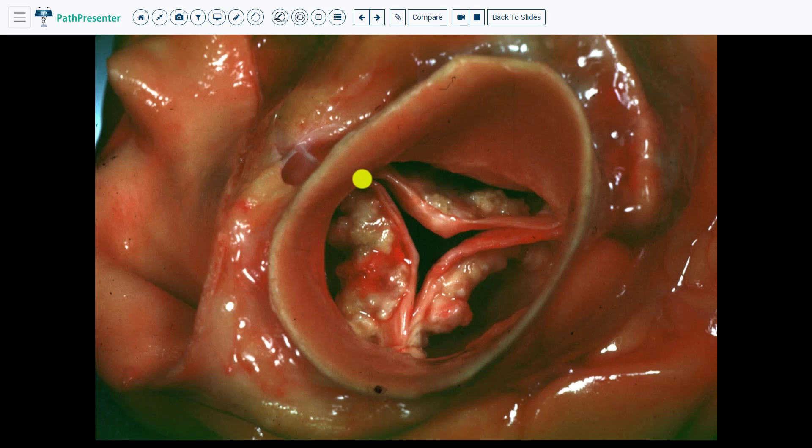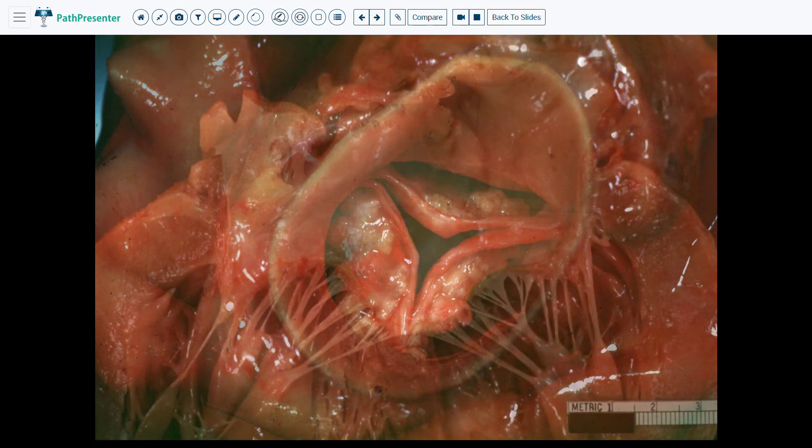This is important to recognize because there are other valvular diseases, which we will be reviewing later, that do not have normal edges of the leaflets. However, calcific aortic valve stenosis does have normal leaflet edges.